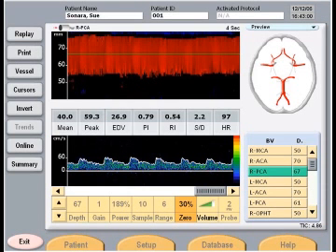Let's look at this in M mode. This is one of my very favorite uses of M mode. If you look at the M mode, now notice that what we have is a red band in depth from about 56 to 78. And I want you to notice what's missing. We do not see any evidence of the middle cerebral artery here. So to find our PCA from the bifurcation, what we do is we tilt the transducer first posterior and then inferior. So we're tilting out of the anterior circulation into the posterior circulation, and that's why we no longer see our MCA.